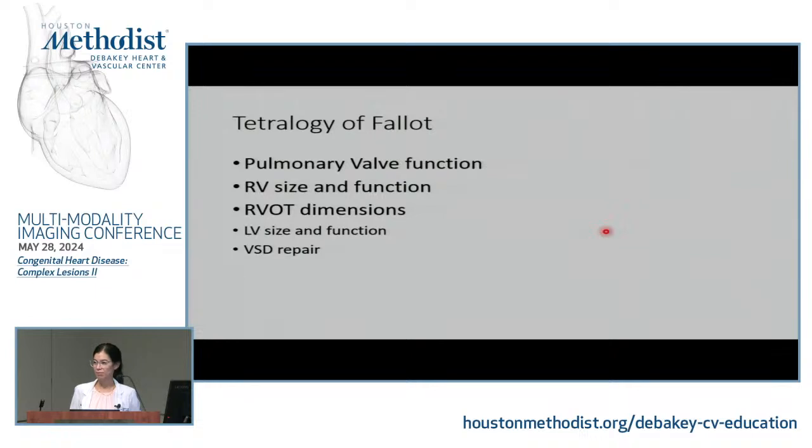Should we replace the valve? Some say no. I agree, but why? Like my son tells me all the time, but why? Because there's enough time that you can keep repeating. That's right. When we replace the pulmonary valve, we replace it with what type of prosthesis?